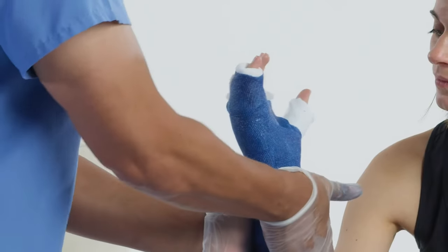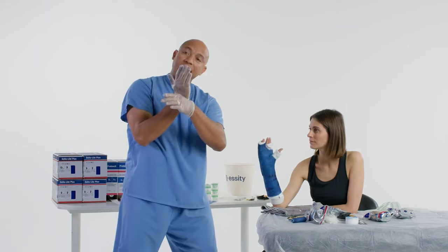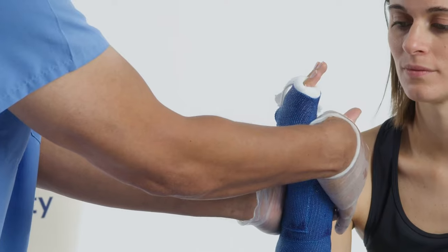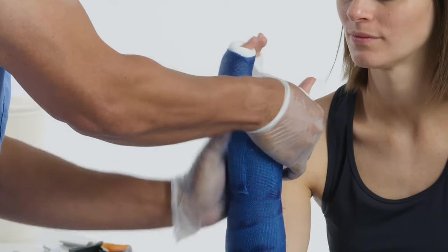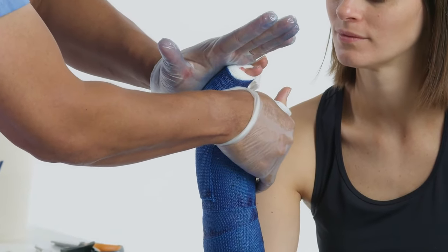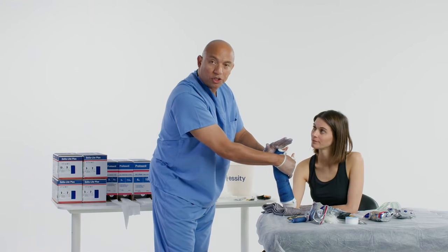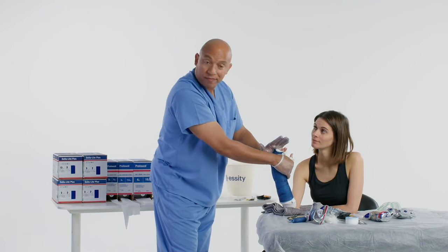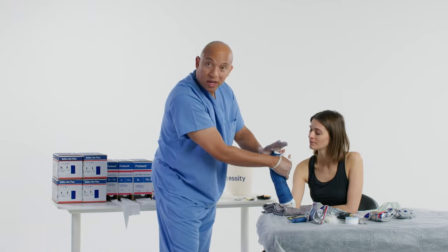Now I'm going to put the patient's arm in neutral position, put my hand on the back of their wrist, and get them back doing the angulation that I need, then bend the fingers down. Because I put that splint on and only wrapped two layers, the splint is interlocking and performing strongly — so now I have more than six to seven layers around the fingers and I don't have to go around the fingers as much to finish the cast.